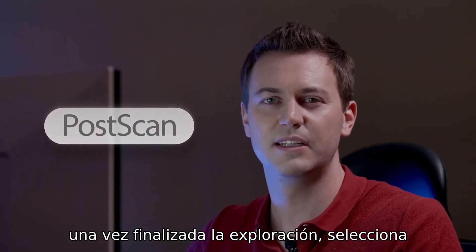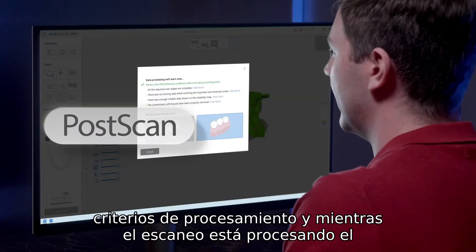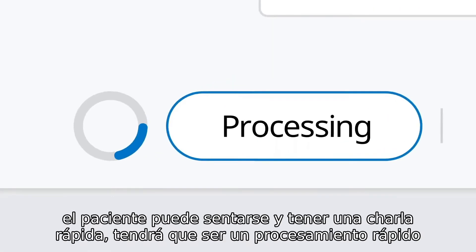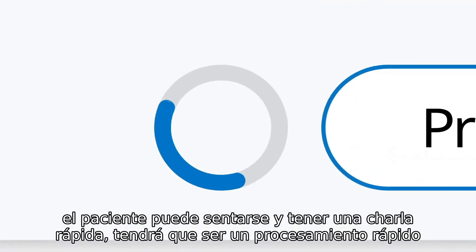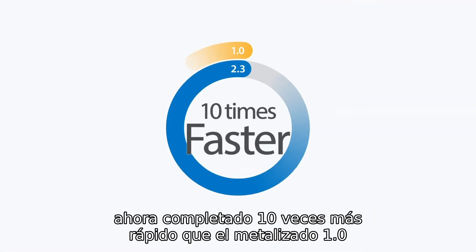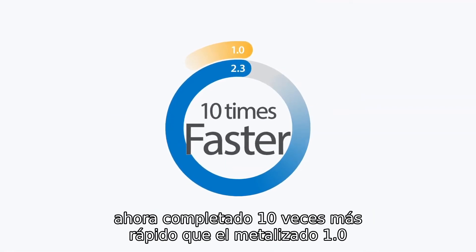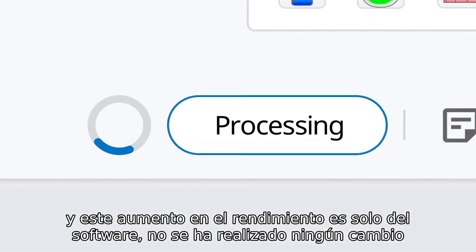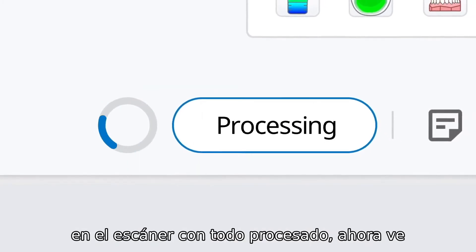After the scan is complete, select the processing criteria, and as the scan is processing, the patient can sit up and have a quick chat — and it will have to be quick. Processing is now completed 10 times faster than MeditLink 1.0, and this increase in performance is just from the software. No change has been made to the scanner.